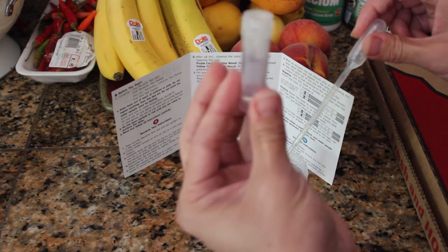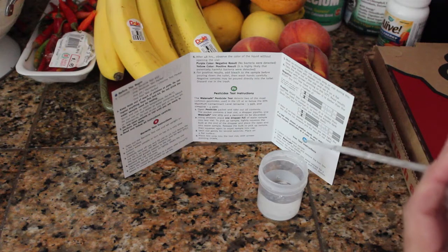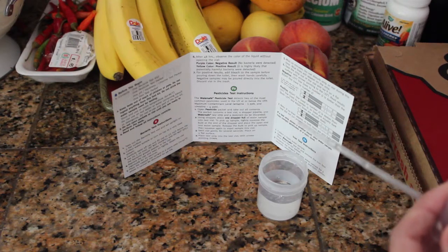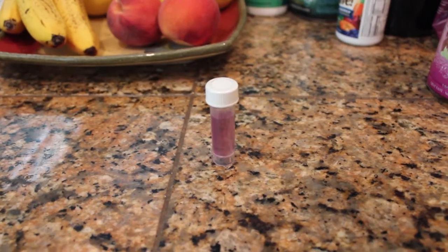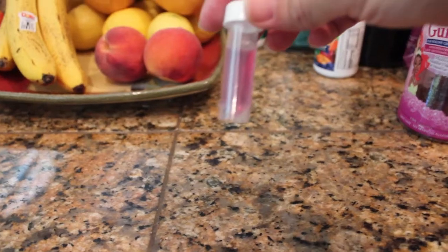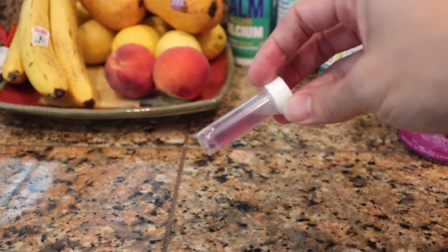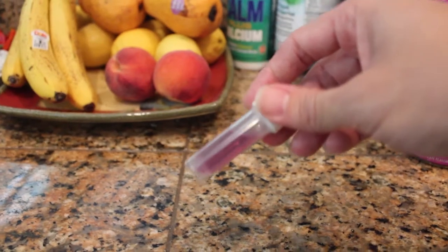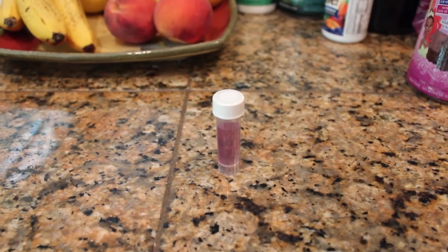We're supposed to come back to check the results in about 48 hours, and we'll see whether the test is positive — it's going to turn yellow if positive — or purple if it's negative. Here we are two days later. Survey says it is purple, which means it is negative for any type of particularly harmful bacteria. Had it been yellow, that would have meant our water was contaminated with bad bacteria. But it's purple, so that's good news.